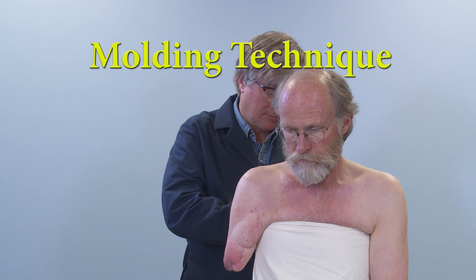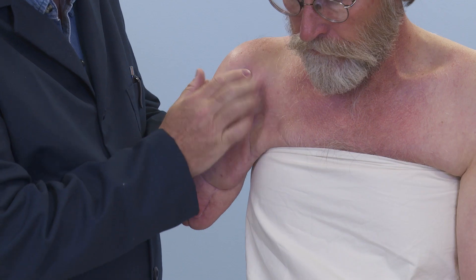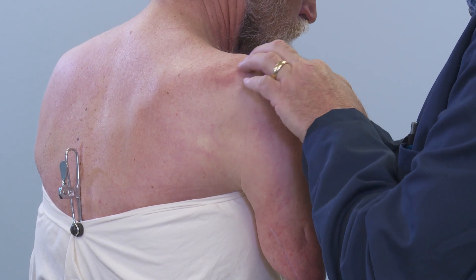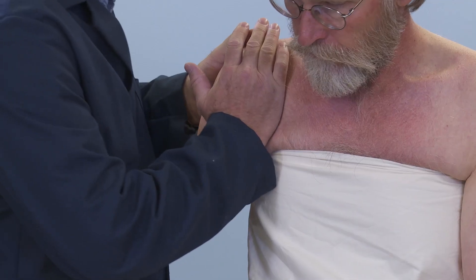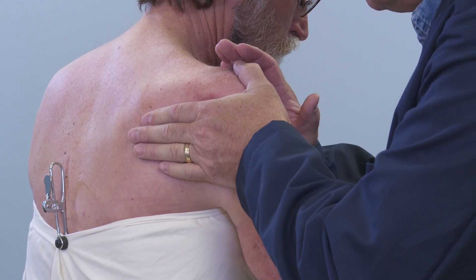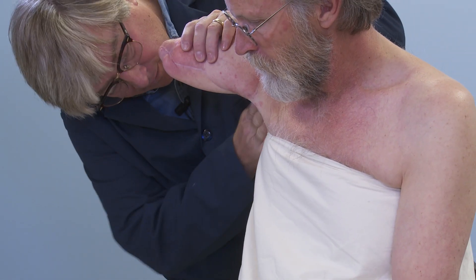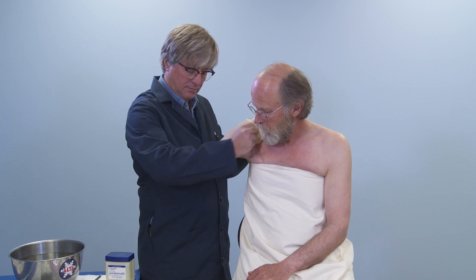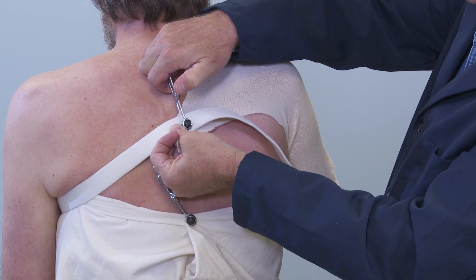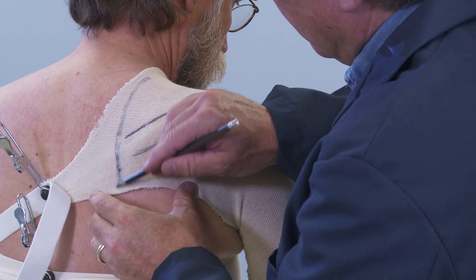Have the patient seated comfortably, with the shoulders slightly below eye level of the practitioner, and drape the patient with a sheet to protect clothing. Examine the bony anatomy of the patient, locating the clavicle and acromion process to the spine of the scapula. Apply a liberal amount of parting agent to the axilla. Place a stockinette on the residual limb, and cut and stretch to encompass the shoulder. Use 1-inch elastic and Yates clamps to hold the stockinette in place. Mark the clavicle, acromion process, the spine of the scapula, and the border of the scapula.